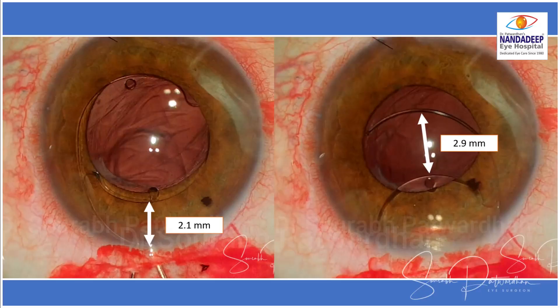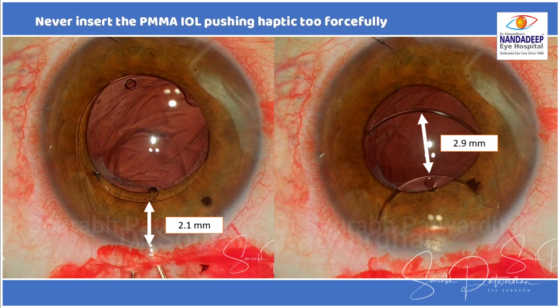Now let's think about why this IOL was decentered. I measured it — one haptic is 2.1mm away from the optic while the other side is 2.9mm. This indicates that while inserting this PMMA IOL, many surgeons push the IOL using the haptic, which can lead to a little bit of kinking of the haptic. On one side the haptic is bent and may not be easily detectable unless you actually measure the haptic position from the optic. Here it's clearly visible that on one side the haptic is much closer to the optic compared to the other side.